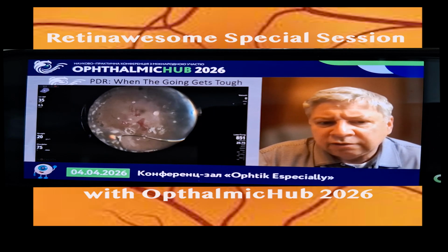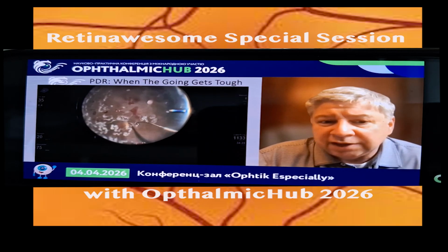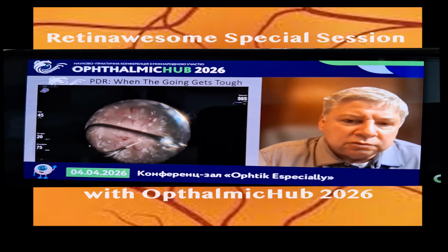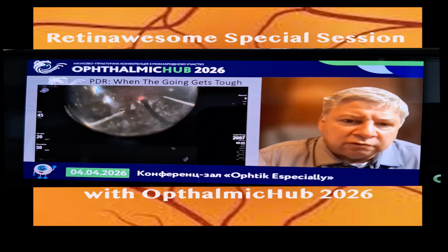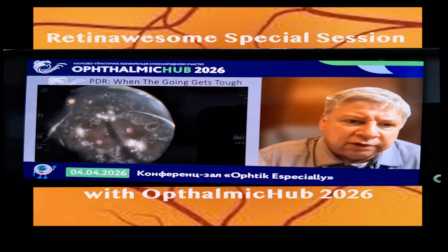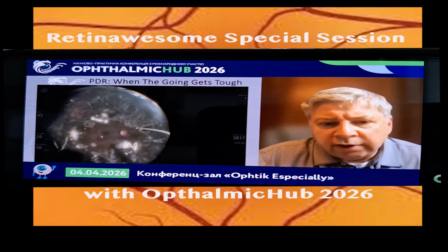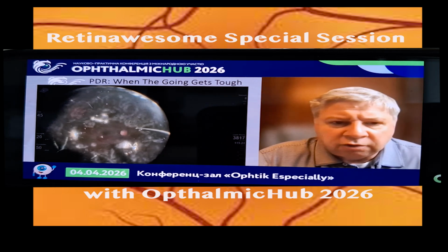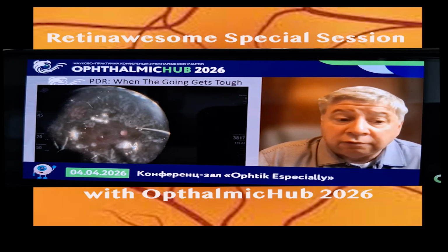And if we treat this leakage, which sometimes we can't see with just conventional microscopy, it reduces our vitreous hemorrhage rate significantly postoperatively. So we got the retina flat. On these patients, I'm injecting methotrexate, and that really seems to help recurrent preretinal membrane formation.